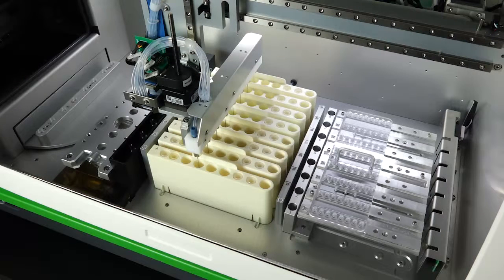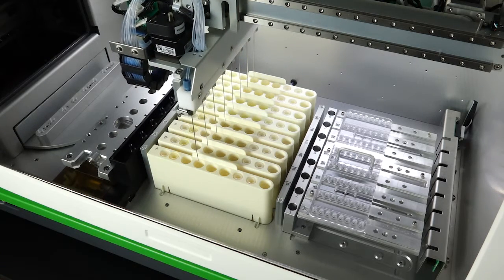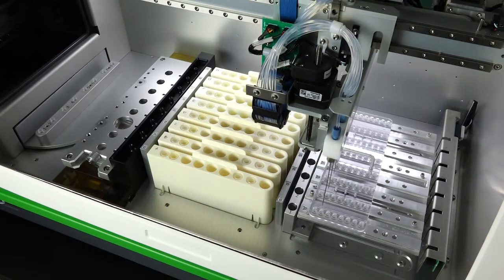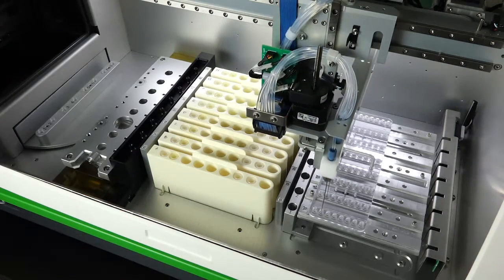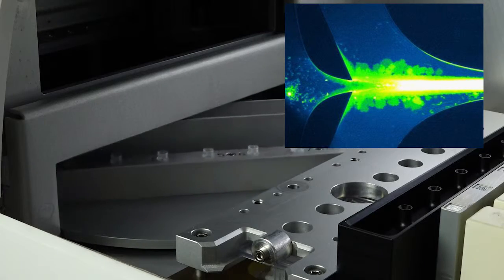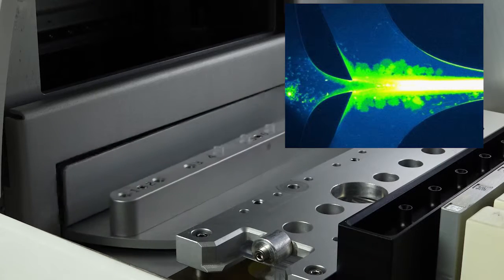Once the eluted DNA is loaded on the turntable, the liquid handling robot in the genome scanner will load the samples one at a time to be run through the proprietary microfluidic chip. The restricted and tagged DNA is mixed with the intercalation dye POPRO as the DNA moves through the microfluidic chip. The liquid handling robot in the genome scanner operates in a similar manner as the robot in the sample processor and is illustrated in the following.